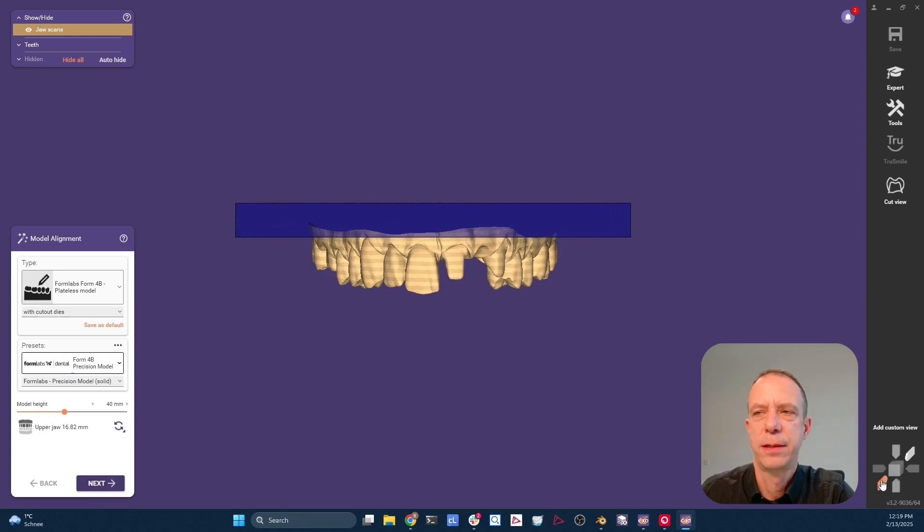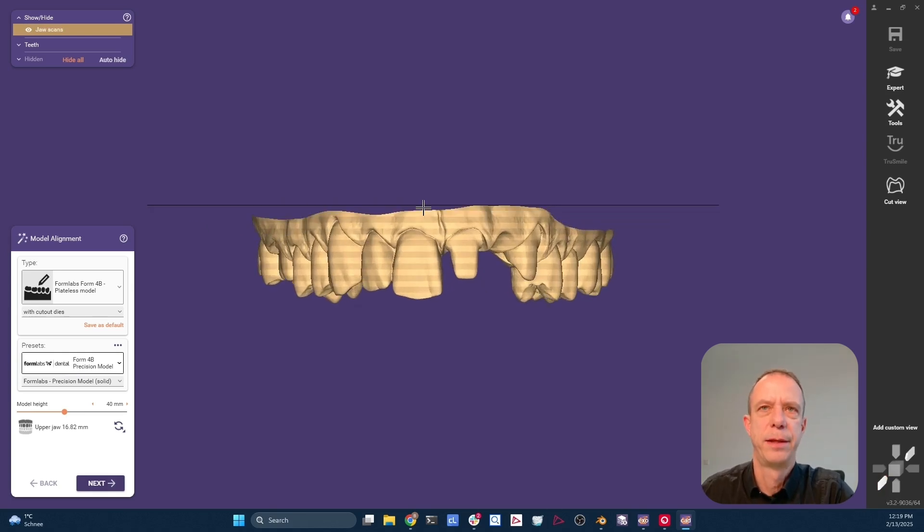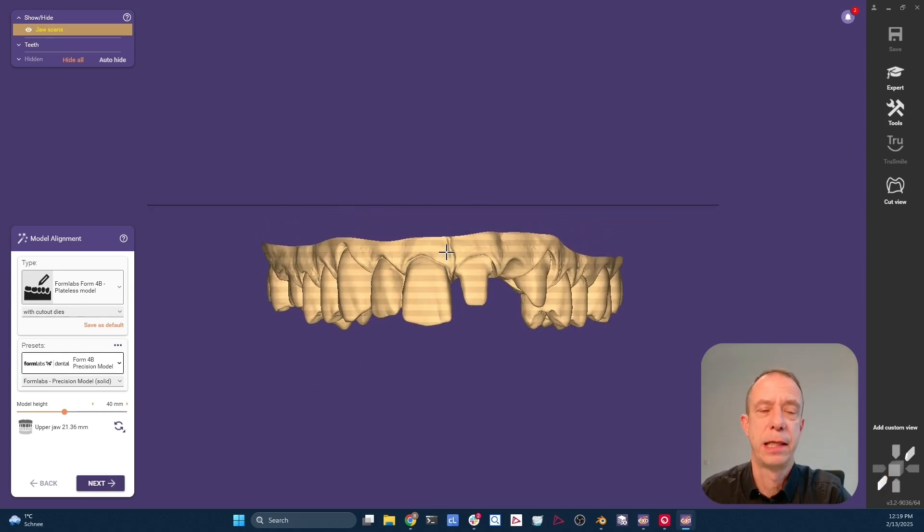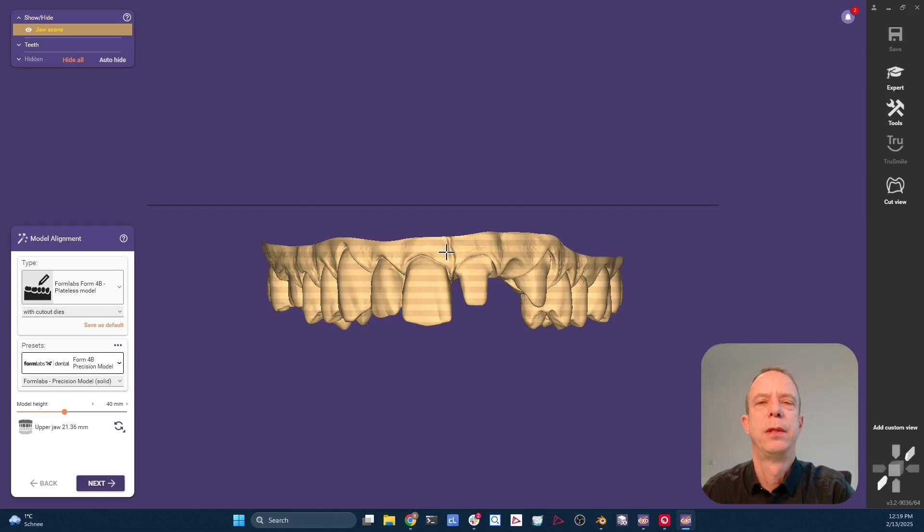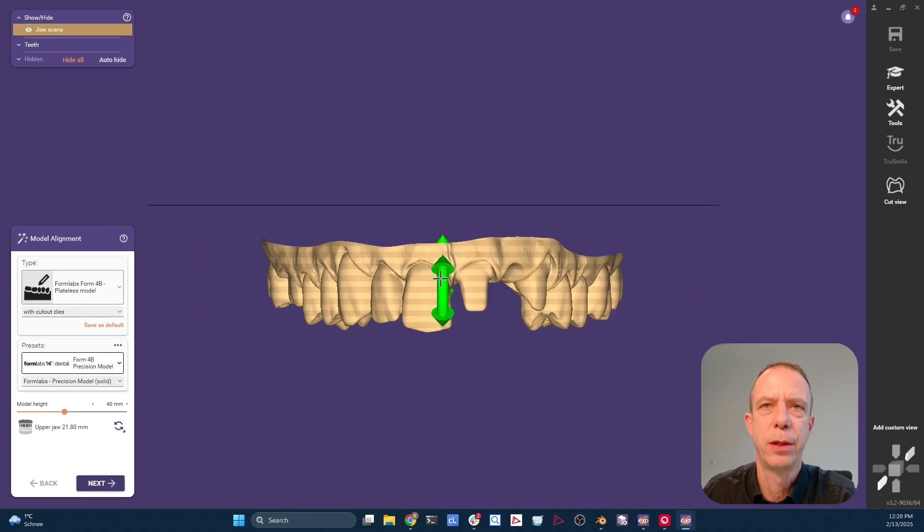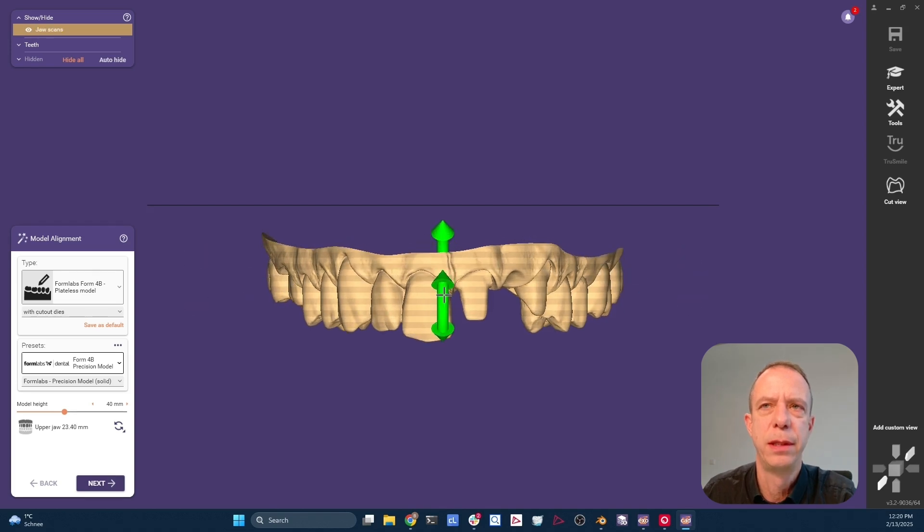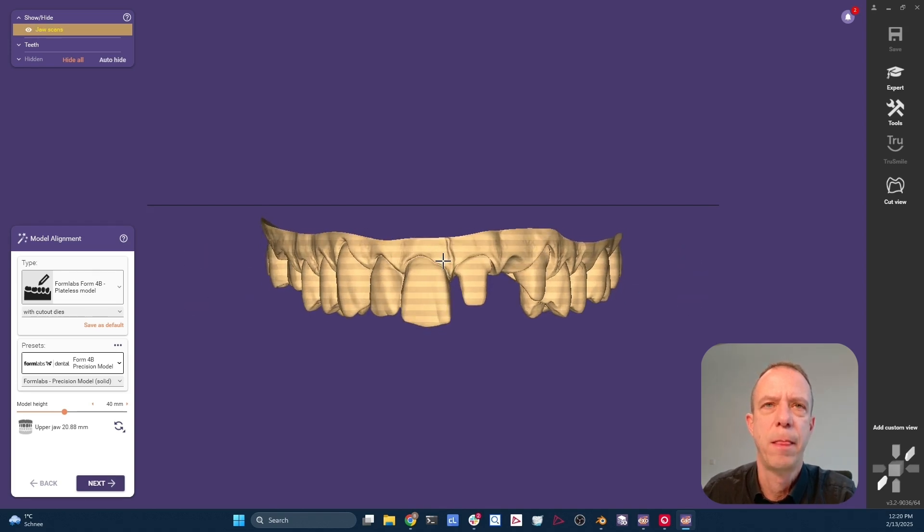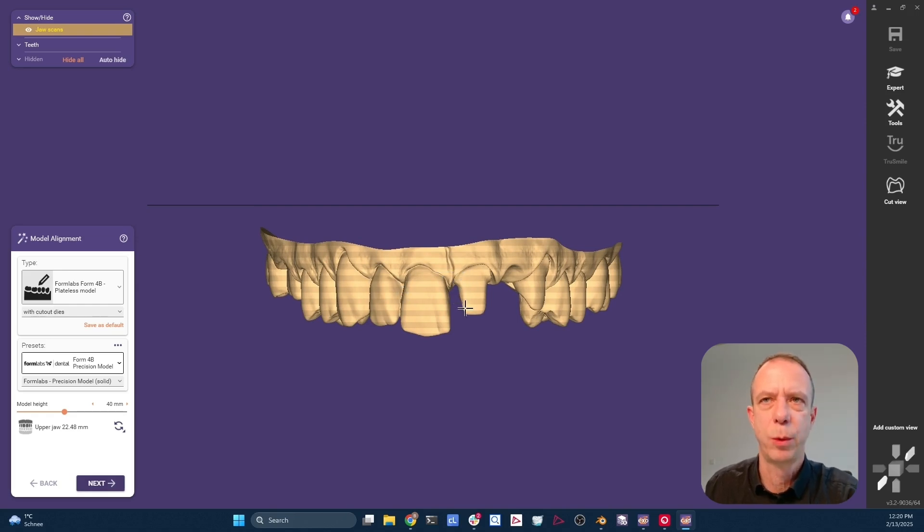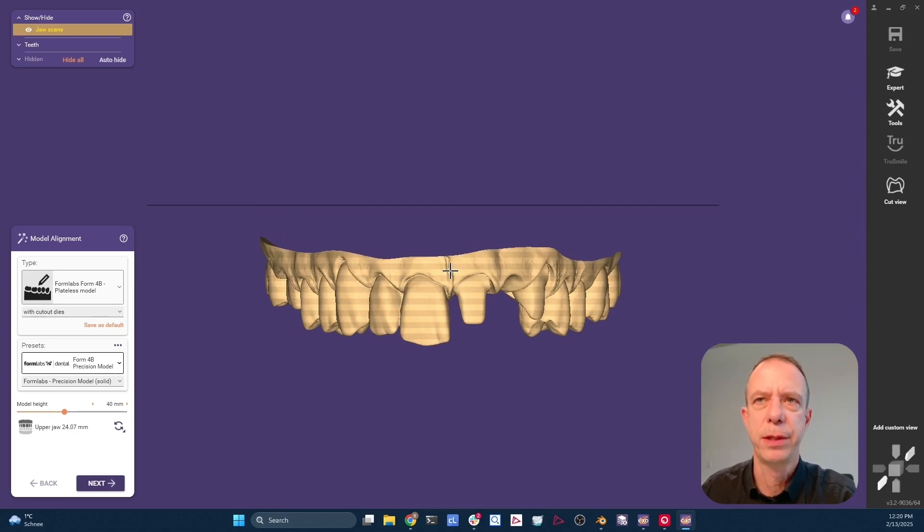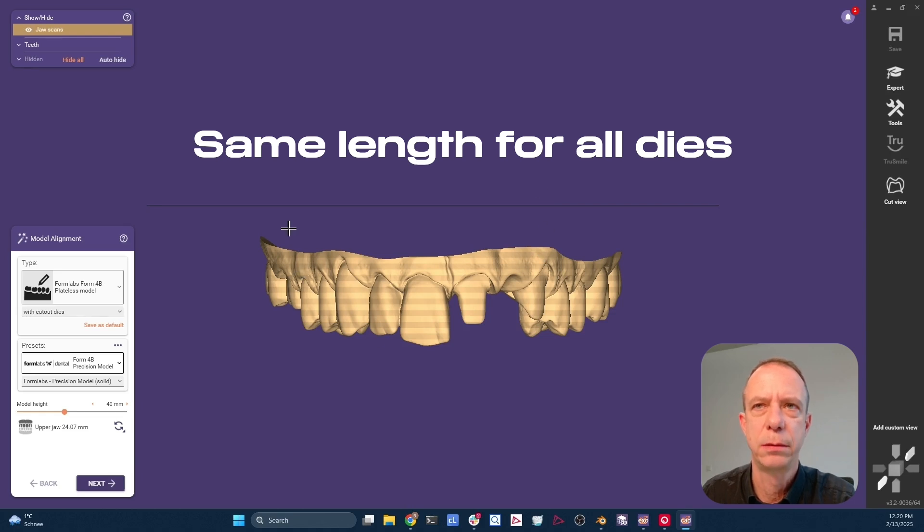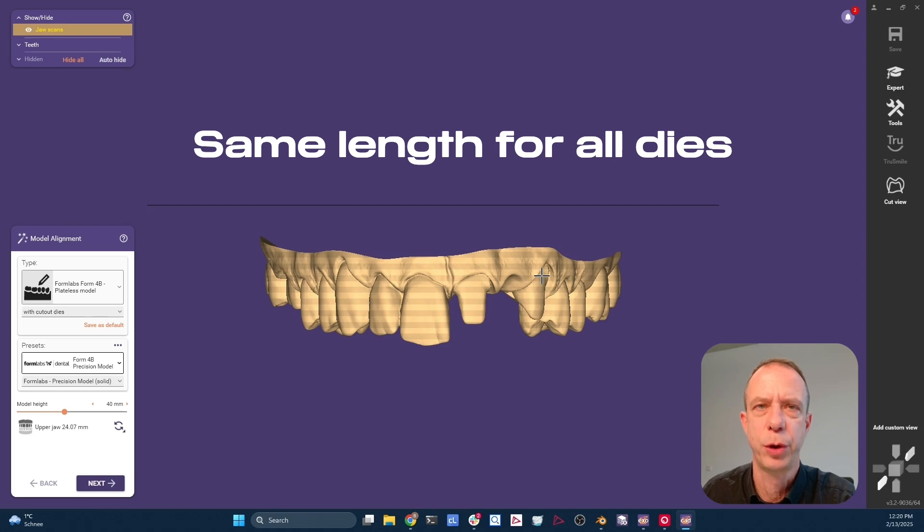Let's align the view to the front view. And as we learned in the previous episode, we want to have all three dies having the same length. So what I do here is tilt the scan a little bit. And why? Because I'm aiming to have the same length of die for this little canine here and the molar.